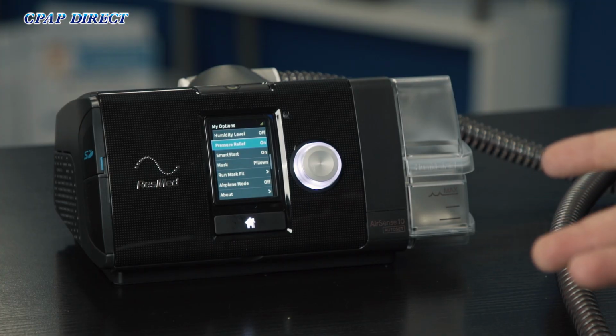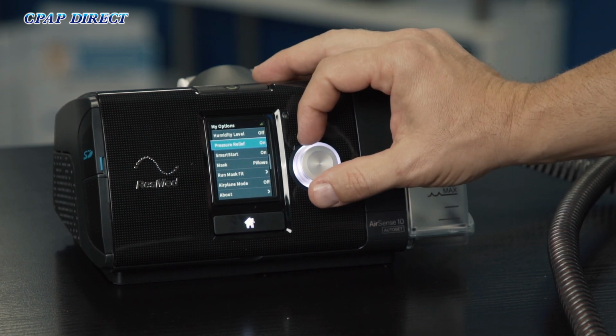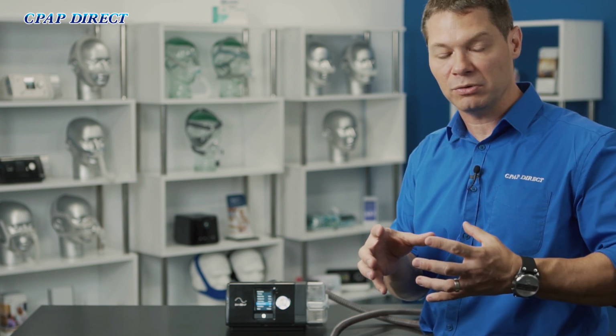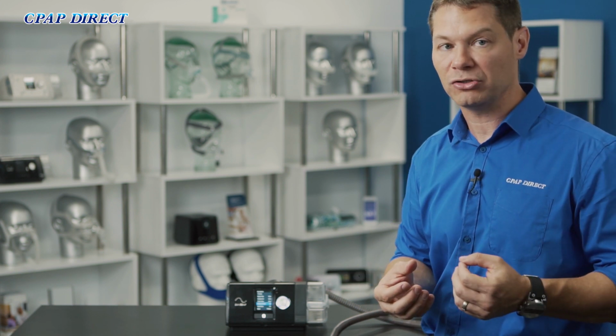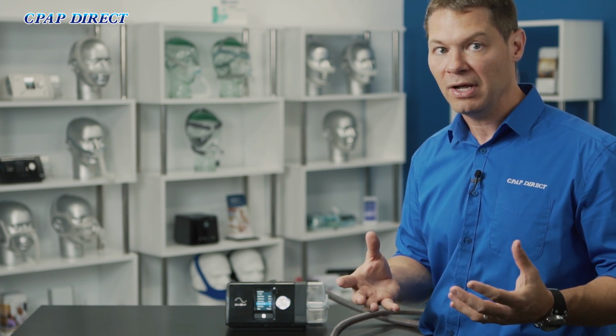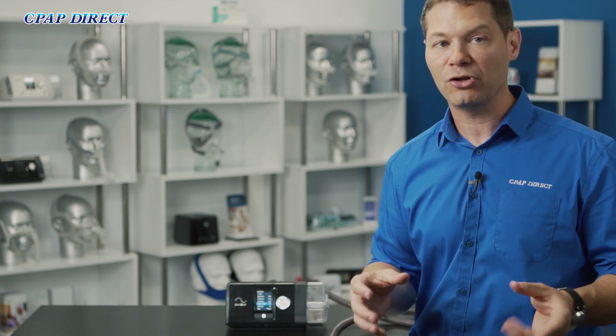The pressure relief function on this machine backs the pressure off when you breathe out to make it easier to exhale. So we have the ability to adjust the level of pressure relief, but that's really there to make the machine feel more comfortable to breathe on. By default, the climate control and the tube temperature are set on automatic, which means that the machine will decide when you turn it on how much moisture to give you, and also how hot the tube should get. It's a good idea to leave them on automatic unless you start having some humidity problems, or unless you're going to go camping. So if you're going to go camping or use 12 volt or some sort of battery system with the device, it's really important to turn the humidity level off.